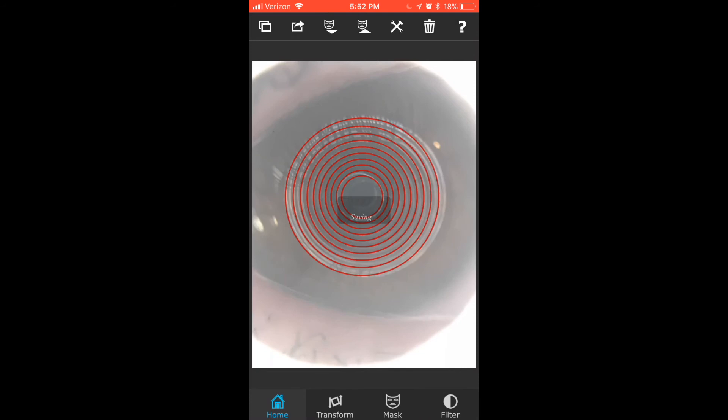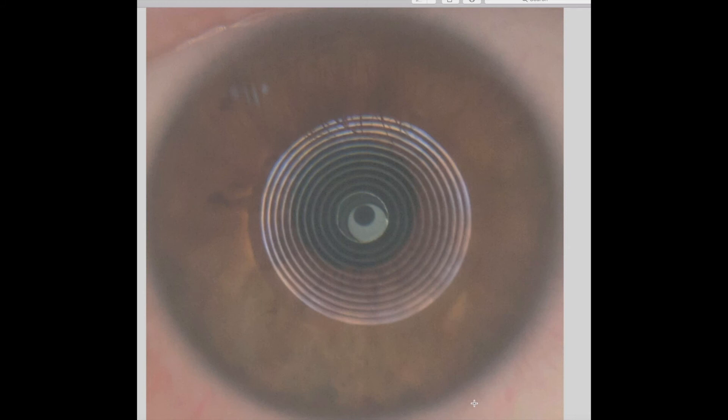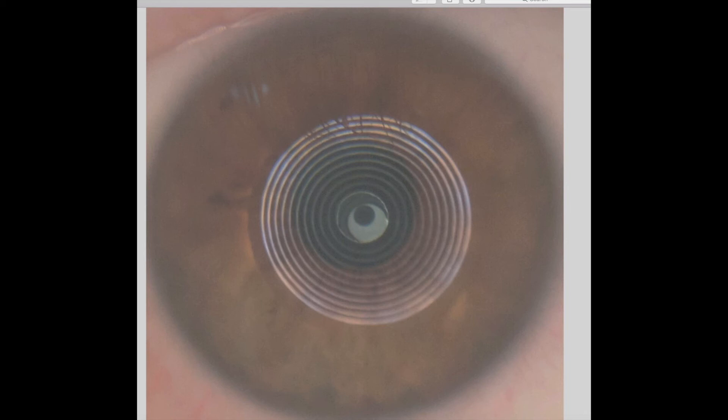This is an example of an image that was captured with the photokeratoscope. And like a lot of Placido Disc images, unless the cornea is grossly abnormal, as may be the case with frank keratoconus, it's really hard to see whether there is cylinder present, okay? Even if I zoom in a little bit, it's hard to tell what's oval and what's not oval. That's why we came up with the idea of superimposing the ring.